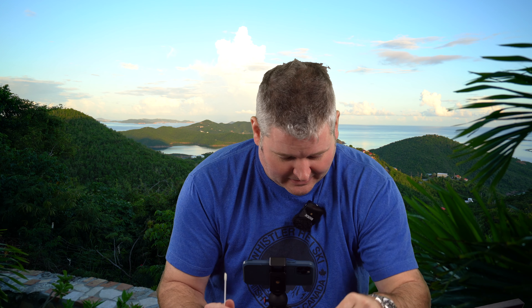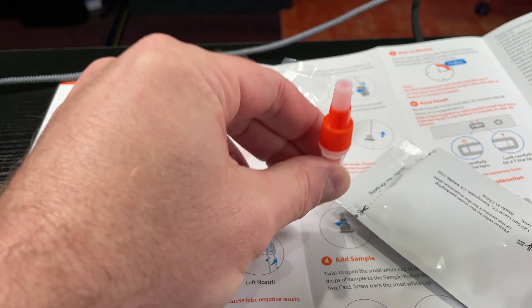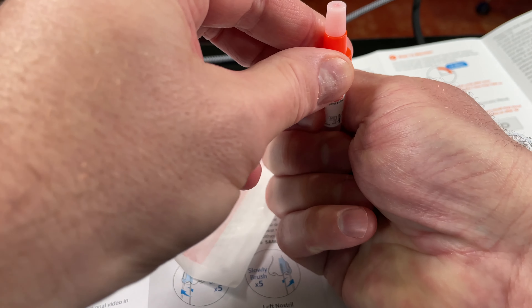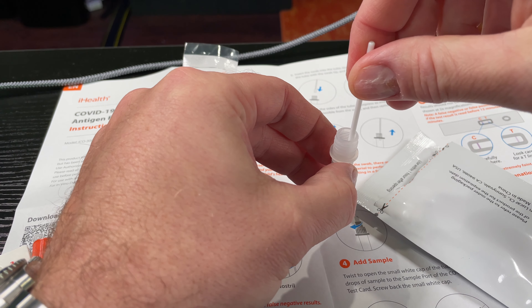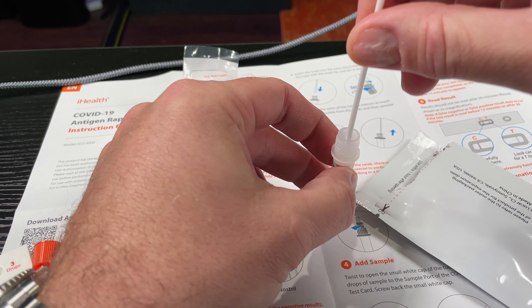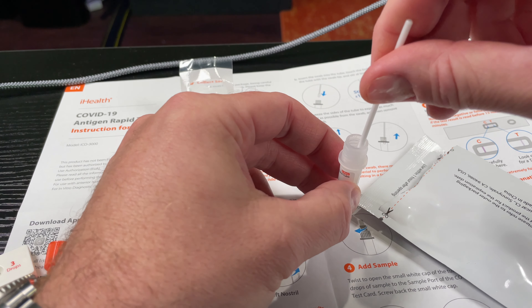Now it says process sample — tap tube vertically. Twist the large orange cap to open the tube. Insert the swab into the tube and touch the bottom of the tube with the top of the swab at least 15 times. I counted to 20 to be sure.